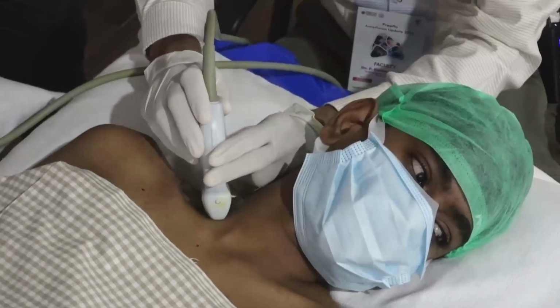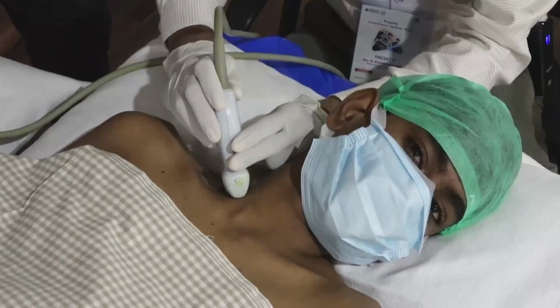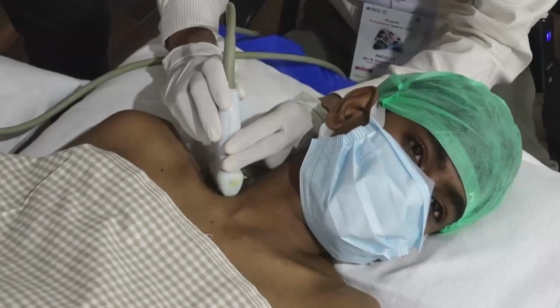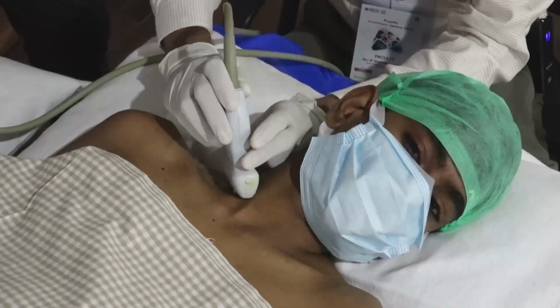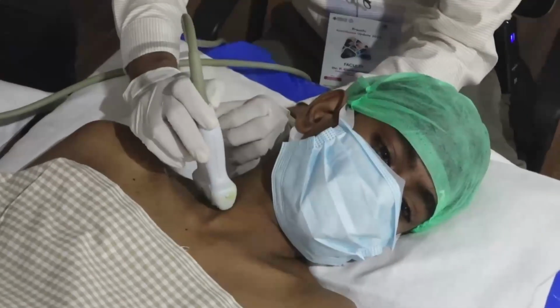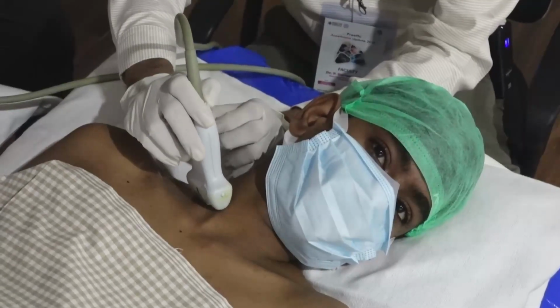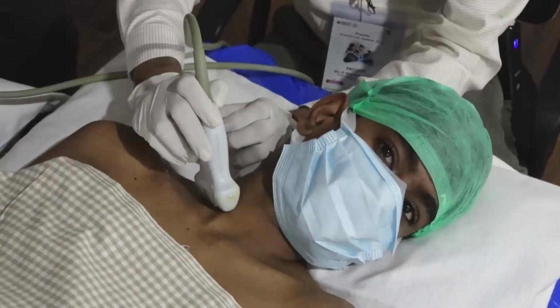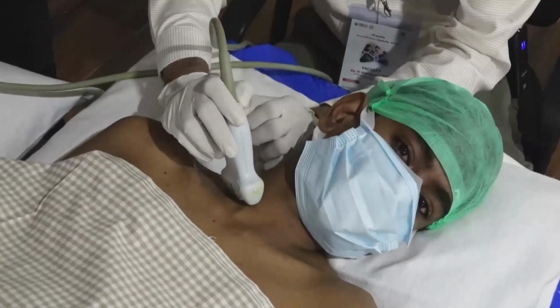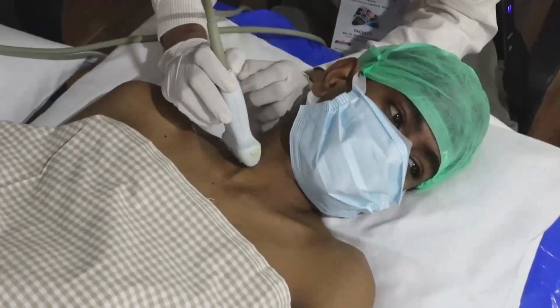cephalad. I am tilting the probe cephalad, and we are seeing two big muscles on either side of this area called the interscalene groove. If you go medially, we can see the sternocleidomastoid muscle, and if I give pressure, I could occlude or compress the internal jugular vein. The next pulsating structure is the carotid. Next to the carotid, we can see one different homogeneous structure, that is the thyroid.